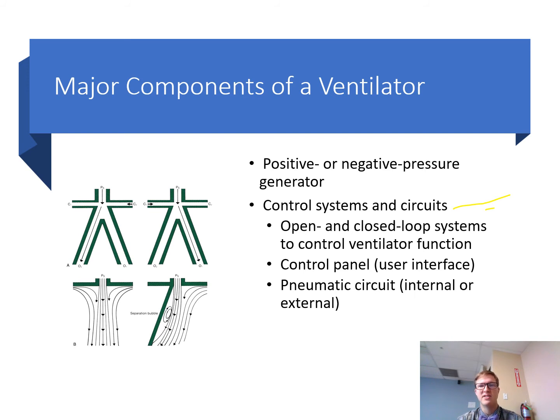That'd be us. So that would be an example of a closed loop system, or an open loop. Is that an example of a closed loop or an open loop system, right? So there are advantages to this where it could potentially help with safety, but what happens if the pulse oximetry just became unstuck from the patient's finger and we're giving 100% oxygen and causing alarm fatigue and a lot of noise and a lot of stress on everybody when the pulse ox just came off their finger, right? So there are some advantages and disadvantages of this type of system.